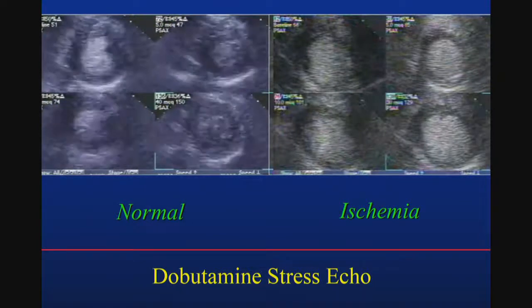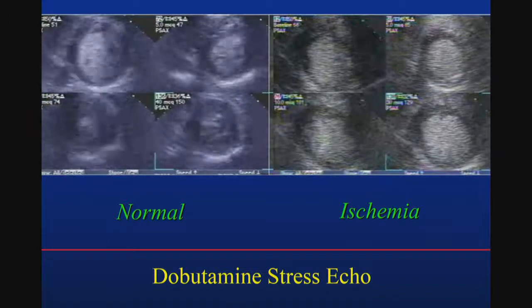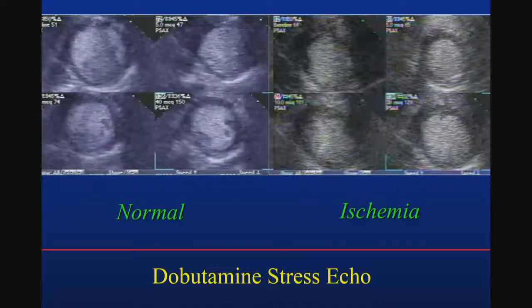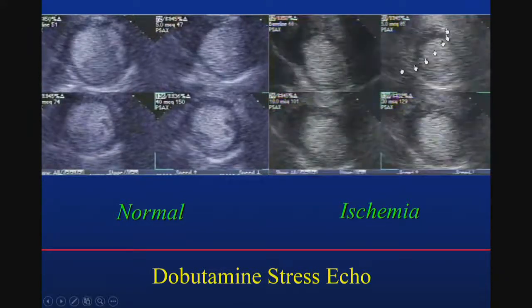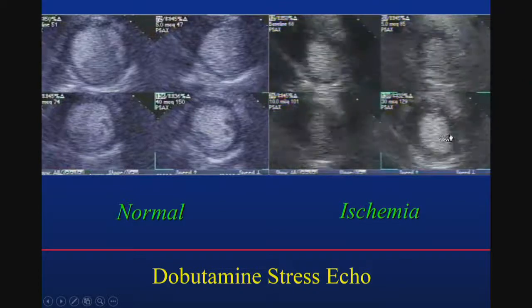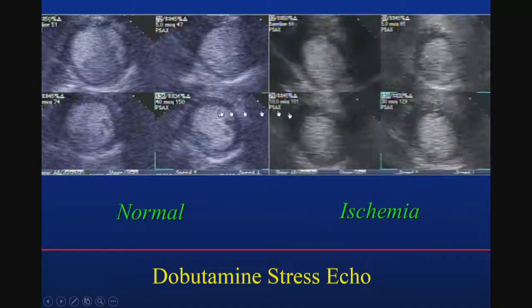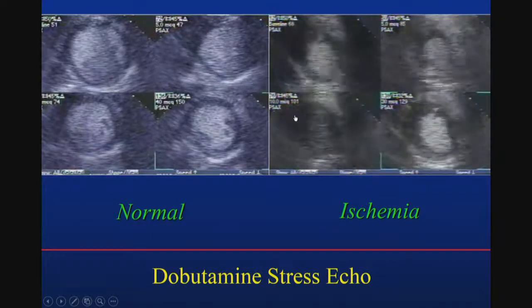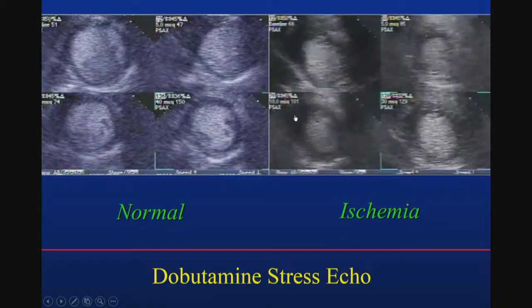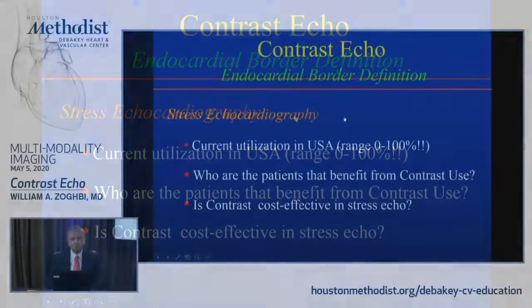Stress echocardiography, I mentioned, is not a current FDA-approved indication, although obviously we use it to enhance contrast, enhance wall motion and improve interpretation. You could see this individual here with a nice abnormal wall motion. Advice for you: decide on contrast at the beginning of your stress echocardiogram, so as not to have non-contrast images versus contrast images. I think this is going to be very important for your overall interpretation.